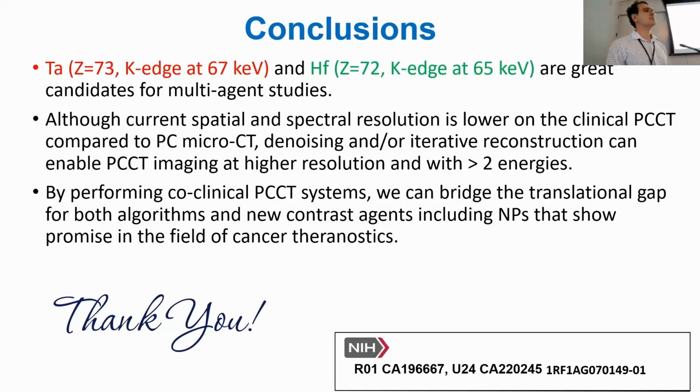Yeah, nice work. So it seemed that the tantalum and hafnium K edges coincidentally line up with your threshold. So if you could set your threshold to something else, would there be other contrast agents that you would find better or more suitable?